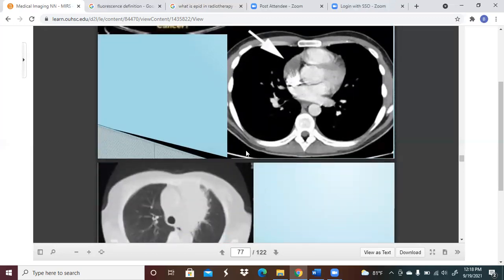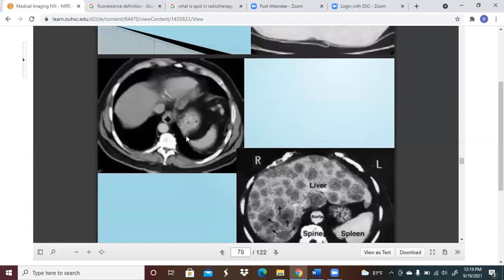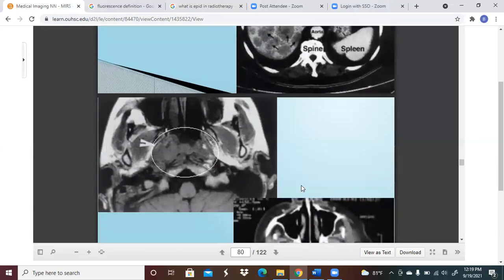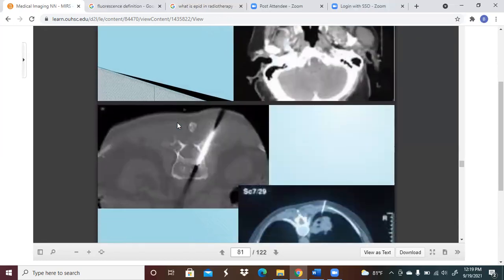These are other things that you can see. This is not looking good. Got something else here. You've got spots in the liver, which may need attention. I mean, you've got several spots here in this liver. I don't know if it's cirrhosis or not. When you get spine, you've got the aorta, you've got the spleen. You may have something going on here inside the head, and a CT can bring out some definition of whatever that is.